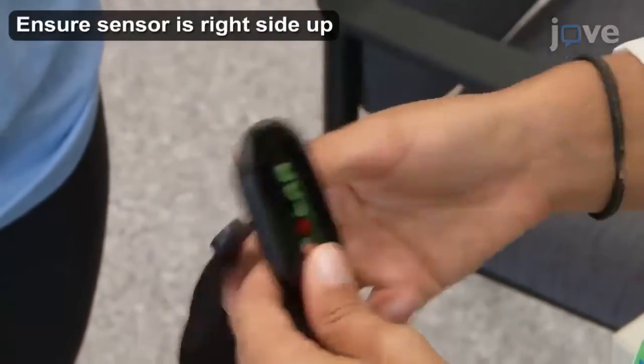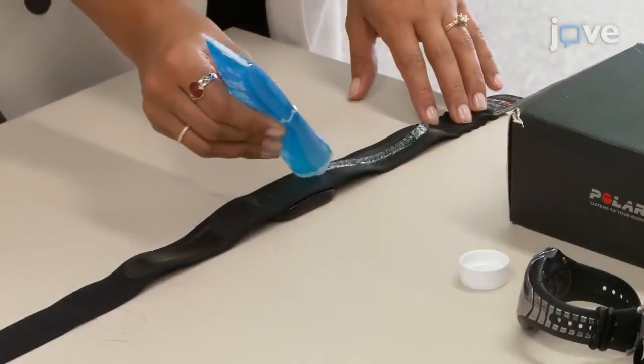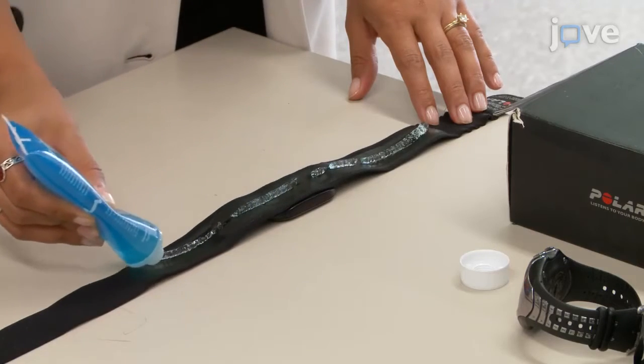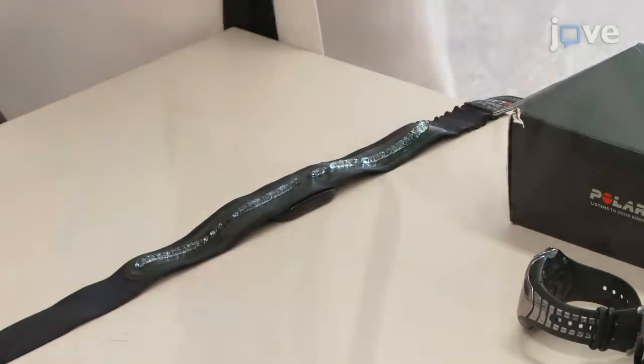Use clip-on buttons to connect the heart rate sensor to the chest strap, and apply a modest amount of hypoallergenic electrode gel to the conductive plastic surface of the strap.